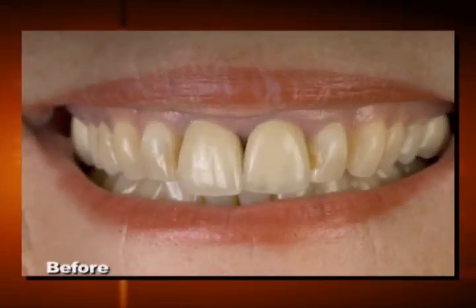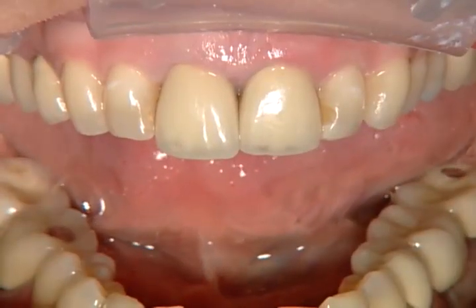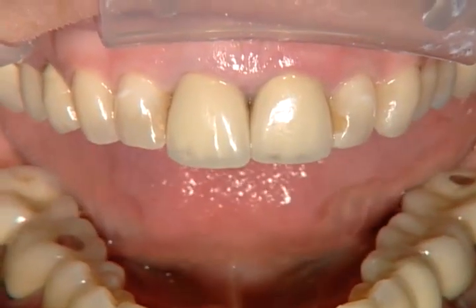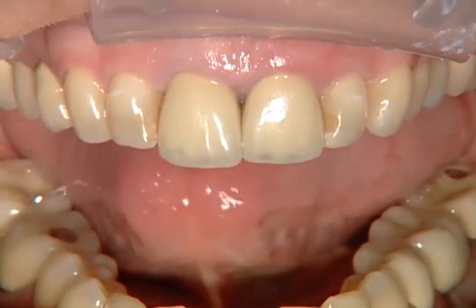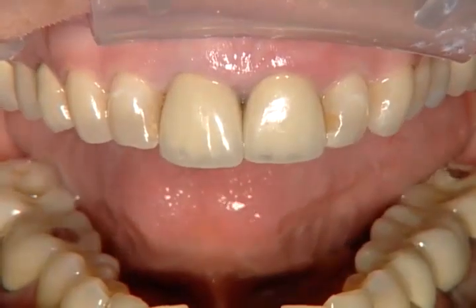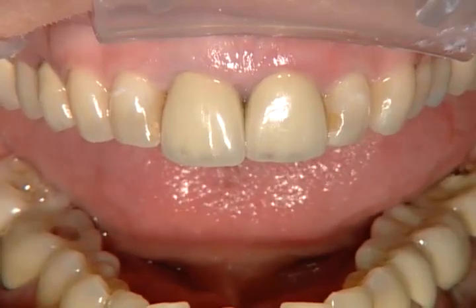On this patient, we've got another aesthetic challenge. We are going to be replacing some PFM crowns that are on tooth number 8 and 9. And you can see when we look a little closer at these that tooth number 8, the crown there is a little bit longer than the crown on tooth number 9. In fact, maybe a little bit is being nice. It's significantly longer than the crown on tooth number 9. And the patient said that it's pretty much been this way since the day that those crowns were placed. The incisal edge translucency is a little strange on both of those, and so we're going in.